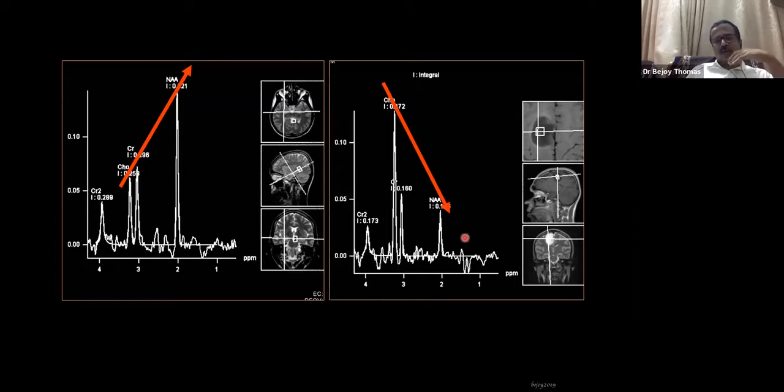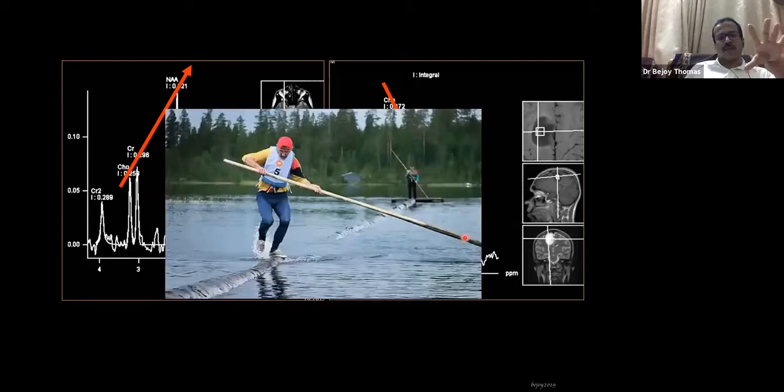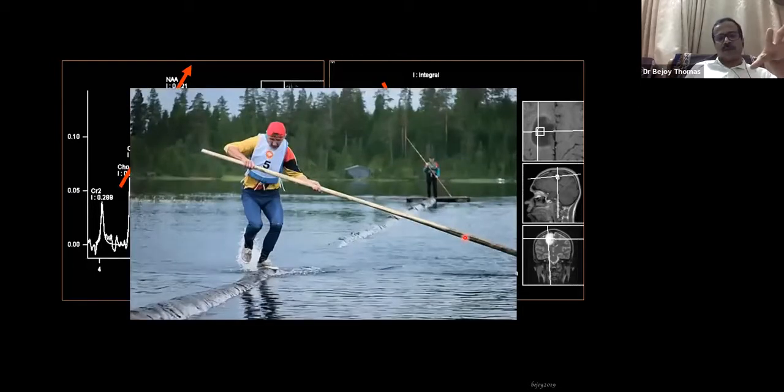This angle is called the Hunter's angle. If you believe in these measurements, we can look at that. But it's basically the choline increasing and NAA reducing in a pathology. That's why there is non-specificity; basically the balance tips if these metabolites change.